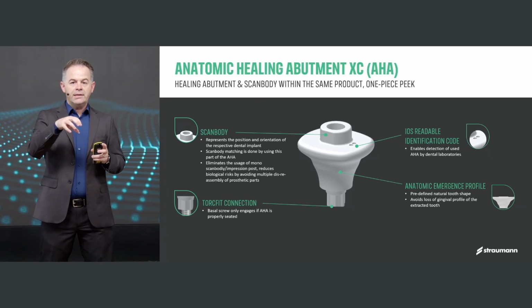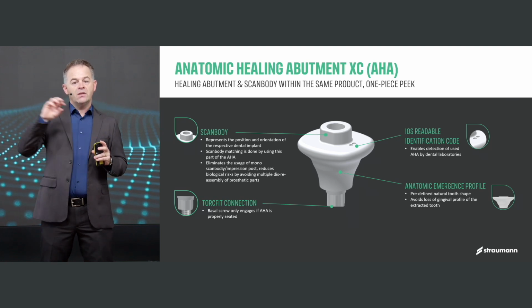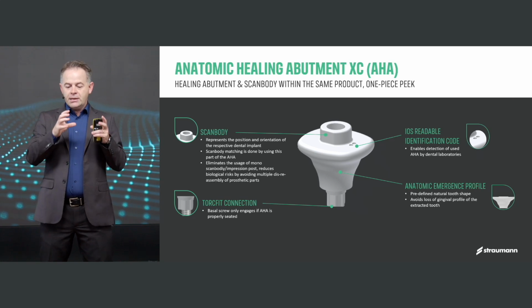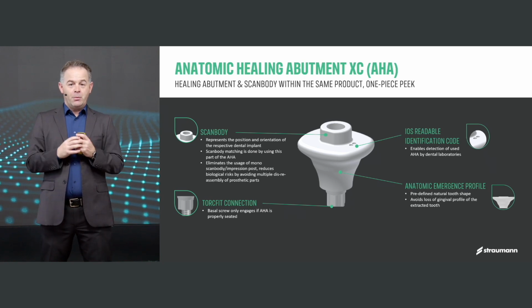So once you place it, your soft tissue will heal all around this. And when you transfer this information to the lab, it's already just like replacing the wheel of a car because the shape is pretty much the same.